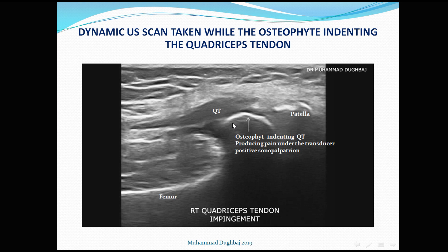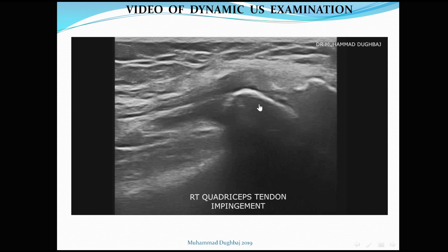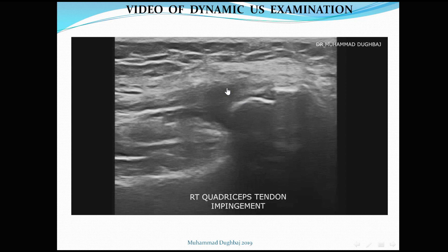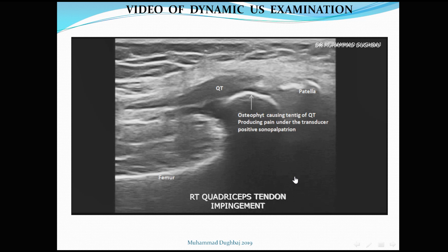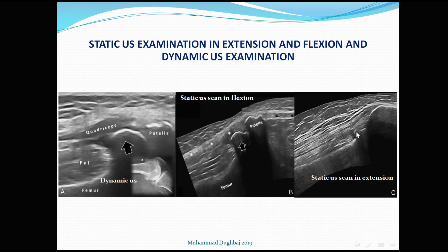Dynamic ultrasound demonstrates that in extension the osteophyte moves away, but in flexion it compresses the quadriceps tendon. The anterior supratrochlear osteophyte from the femoral condyle compresses the quadriceps tendon during flexion, causing pain. This osteophyte causes tenting of the quadriceps tendon with positive sonopalpation under the transducer, confirming our expectation. Beyond 30 degrees of flexion, the anterior osteophyte is clearly seen compressing the quadriceps tendon.